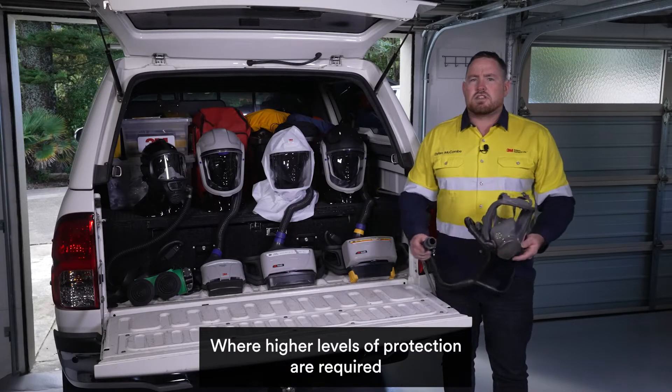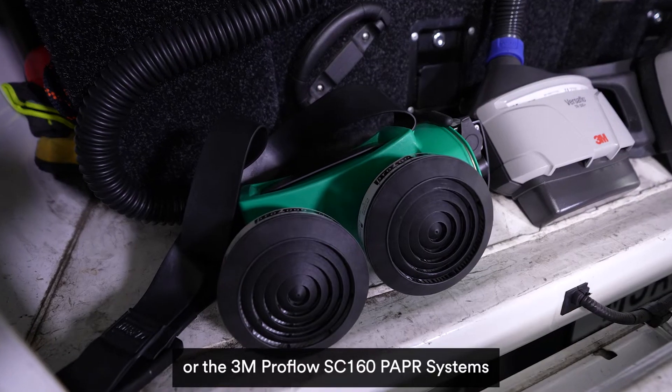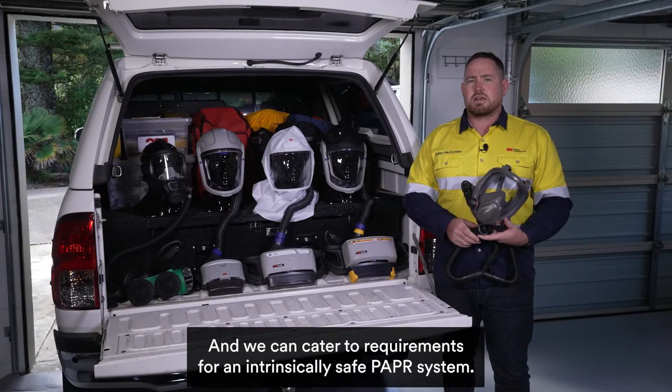Where higher levels of protection are required, a tight-fitting respirator can be utilised with the 3M Versaflow TR600, TR800 or the 3M ProFlow SC160 PAPR systems, and we can cater to requirements for an intrinsically safe PAPR system.